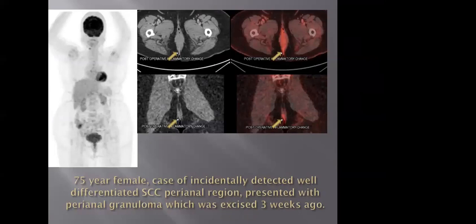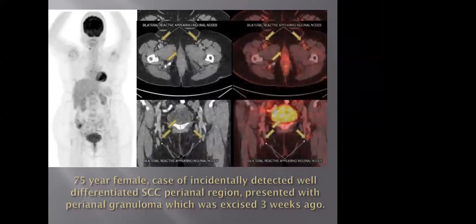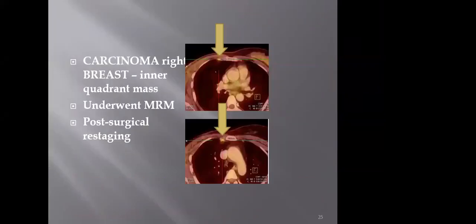There were a few inguinal nodes, but they were reported as reactive and the patient did not undergo any further surgery or treatment. On follow-up, the patient was completely asymptomatic, the PET scan was negative and the disease was under control.